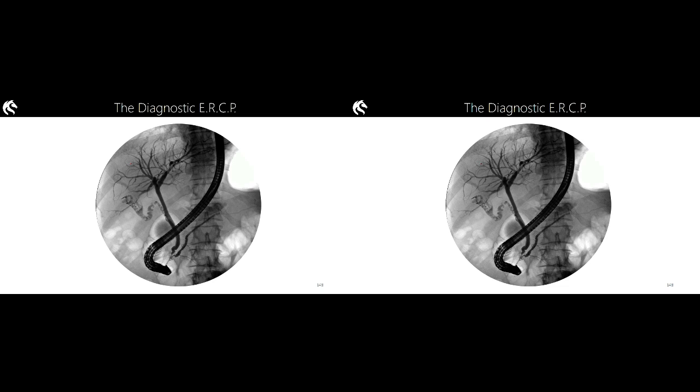When a patient has had a diagnostic ERCP, giving you some homework answers right here, the endoscope is going to come down the patient, cross over into their right side, and you can even see the outline here of the first part of the patient's bowel. Great.